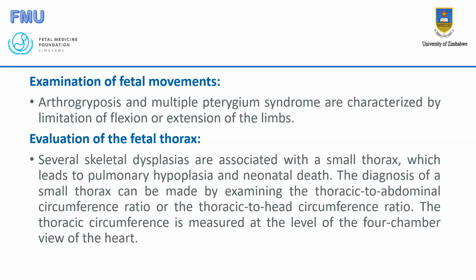Or you can ask the mother to just take some star jumps. Normally, that tends to shake up the baby and wake up those sleeping babies. So remember this, that you can do certain maneuvers to encourage the baby to move. So the absence of movements will bring us to two conditions. We have arthrogryposis and multiple pterygium syndrome.